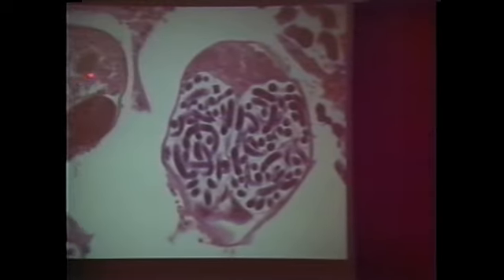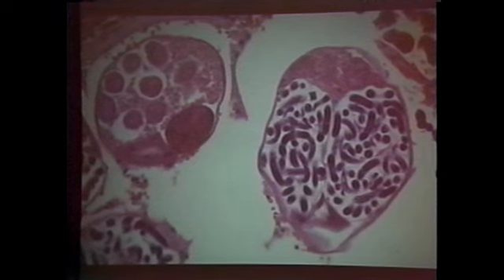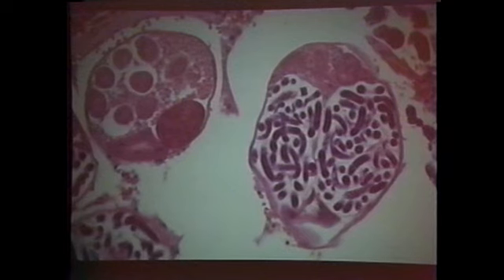One thing that you will find in both male and female worms is sperm. The males copulate with the females, and she keeps sperm in an area of her uterus called the seminal receptacle for long periods of time. So you can see sperm in both males and females. Sperm in nematodes are eosinophilic, circular to ovoid bodies with a dark nucleus. These are sperm, that's sperm, and that's sperm in a male.